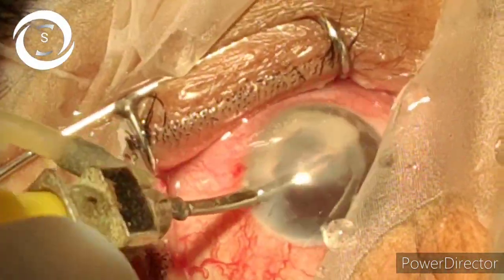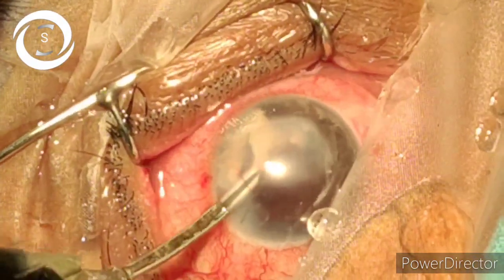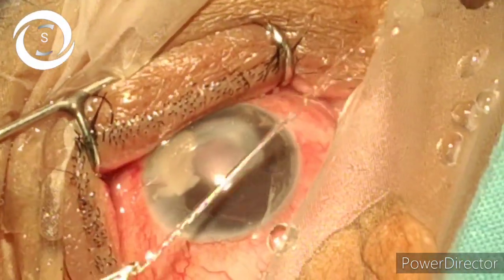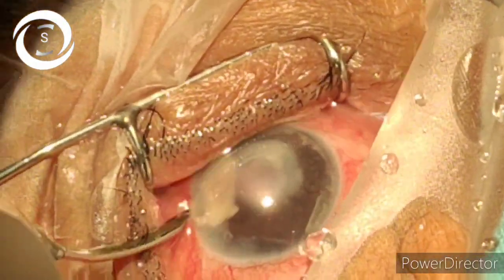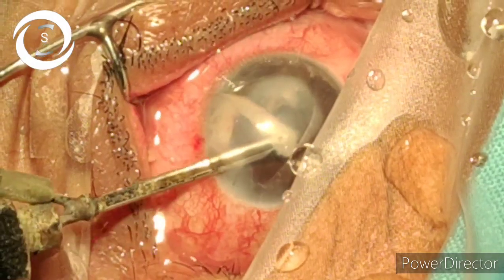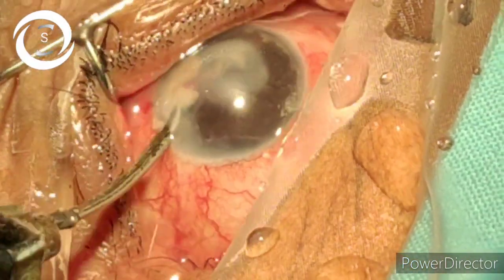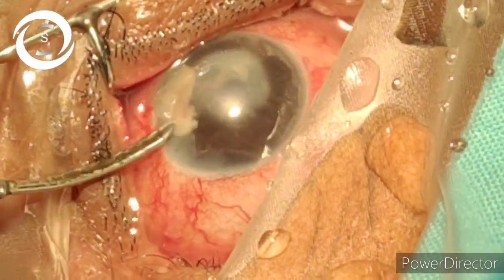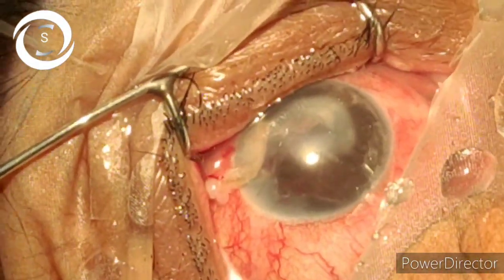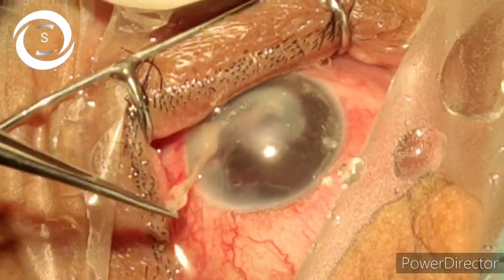You can see the membranes — they are organized — and now here I am peeling one membrane. You can see that basically the ulcer was just in the center of the cornea, and all that appeared to involve the whole cornea was actually the anterior chamber full of exudates.